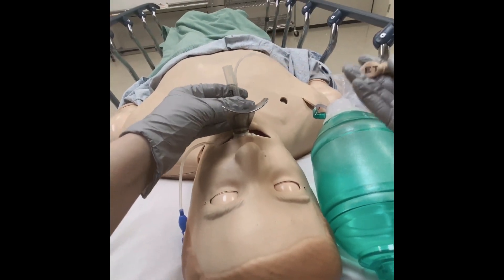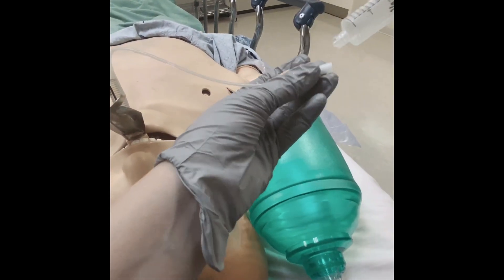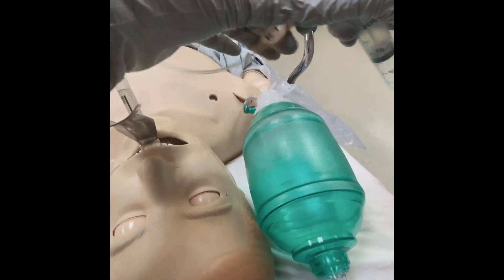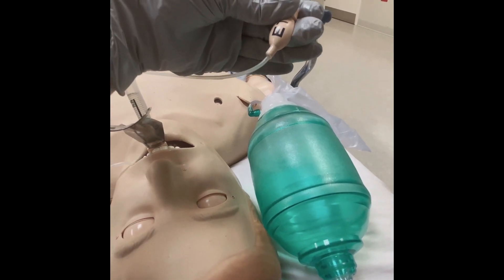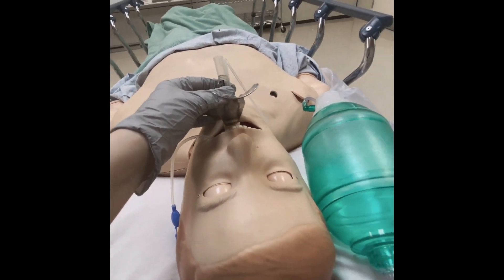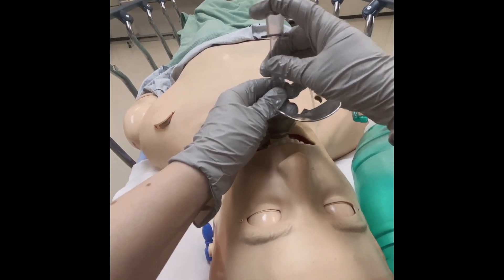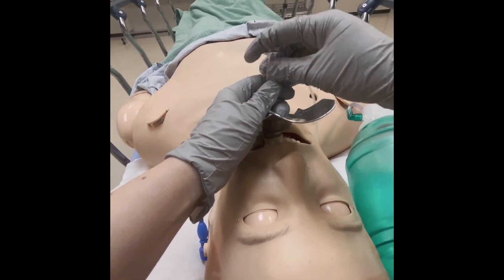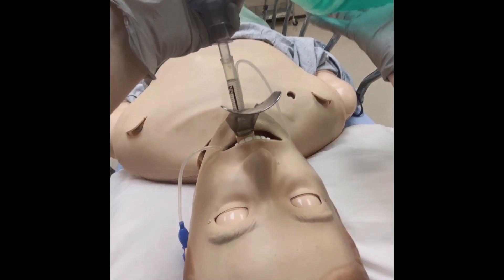Once the ET tube is in, inflate the cuff. Confirm ET tube placement with BVM by using the BVM connector device. Look for chest rise or end tidal CO2.